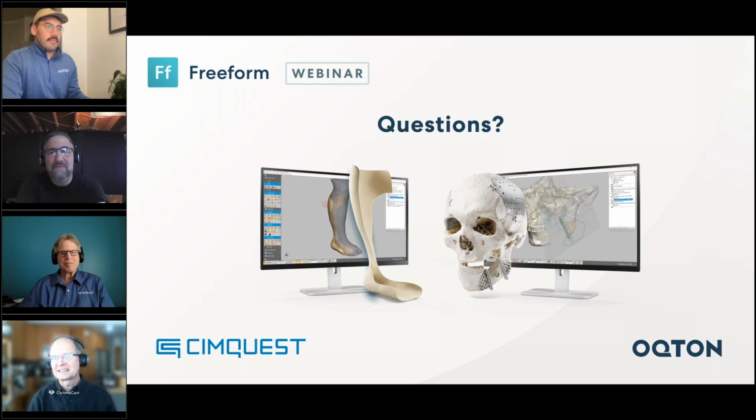But what we can say is one of the world's biggest service providers for surgical planning, which is the 3D Systems Healthcare Services Group, completely independent from Oqton. They use Freeform. They're doing in excess of, I think it's as many as 15,000 patient-specific cases a year now, for a combination, mainly CMF, but also orthopedic extremities. And their workflow is 100% Freeform. If you took out Freeform, it would be a tough workflow to be as efficient and quick as it is today.